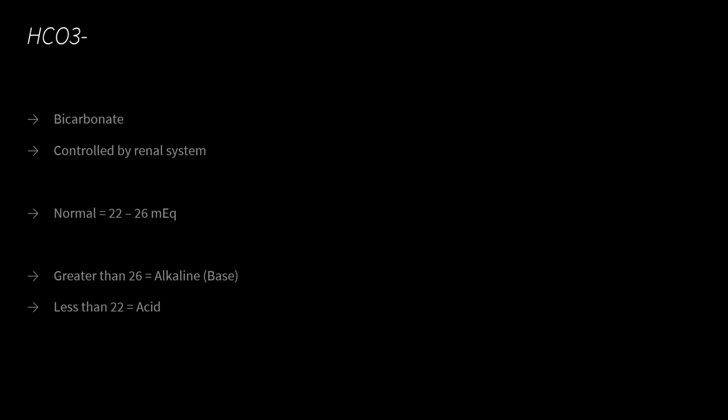So if my bicarb comes back at 28, well, that's a base, or that's alkaline. If my bicarb would come back at 20, that's an acid.